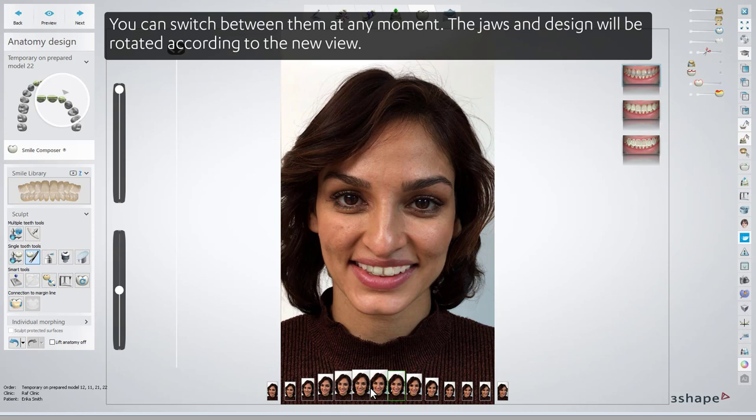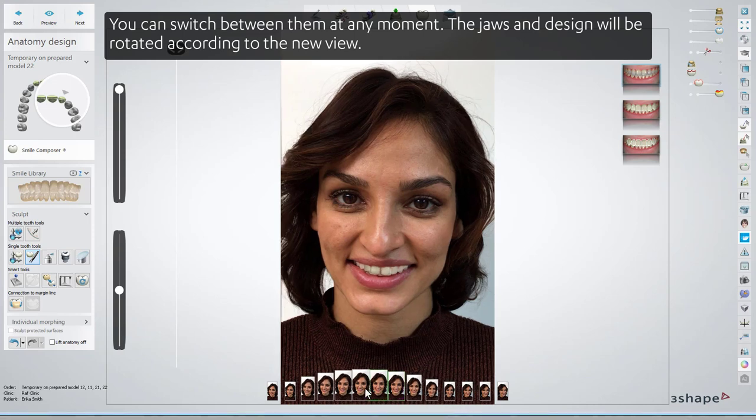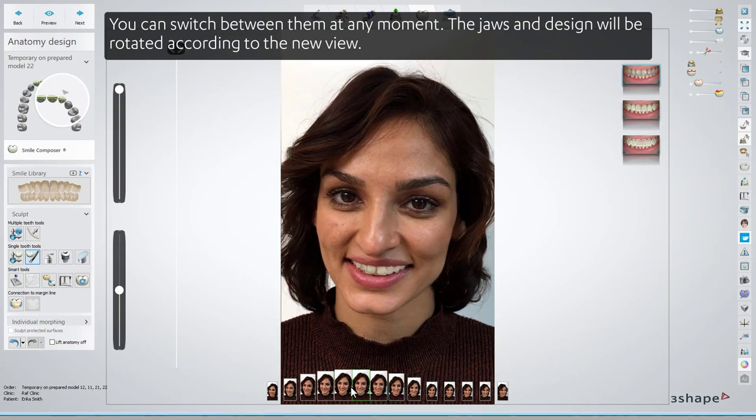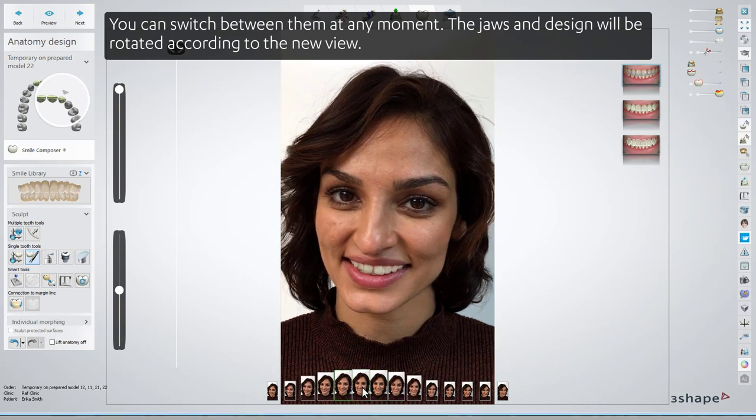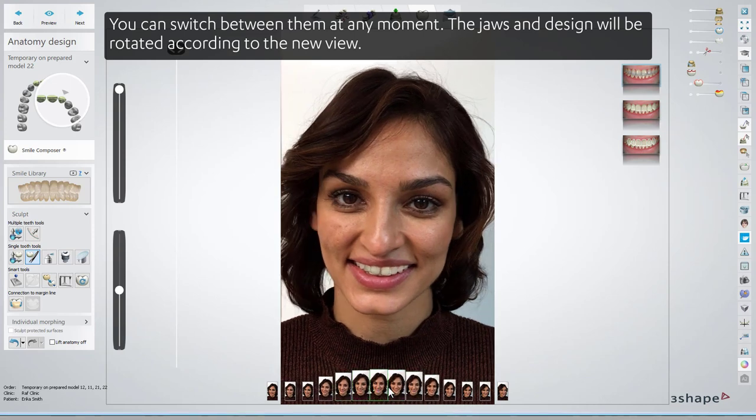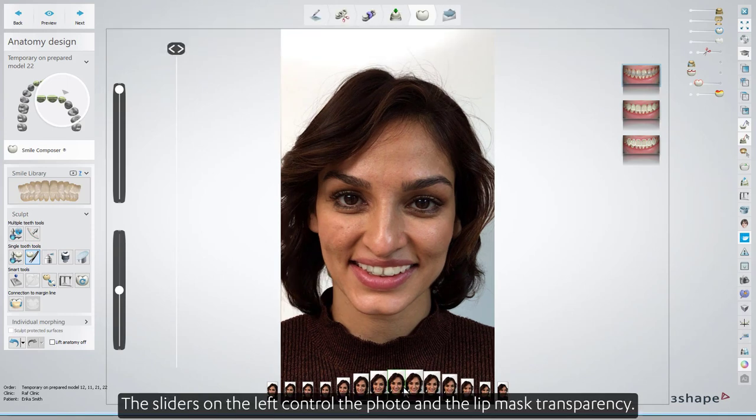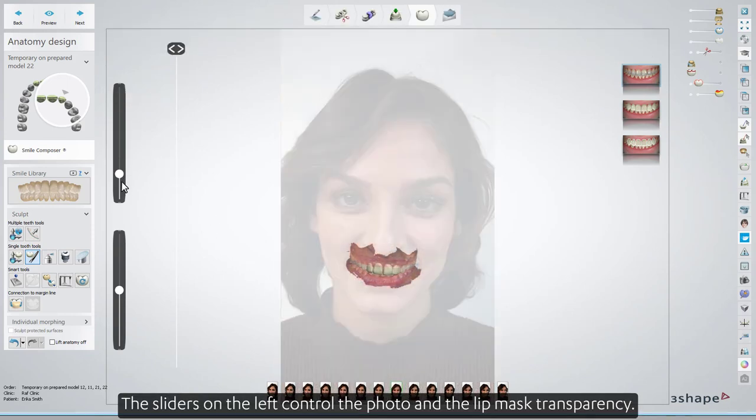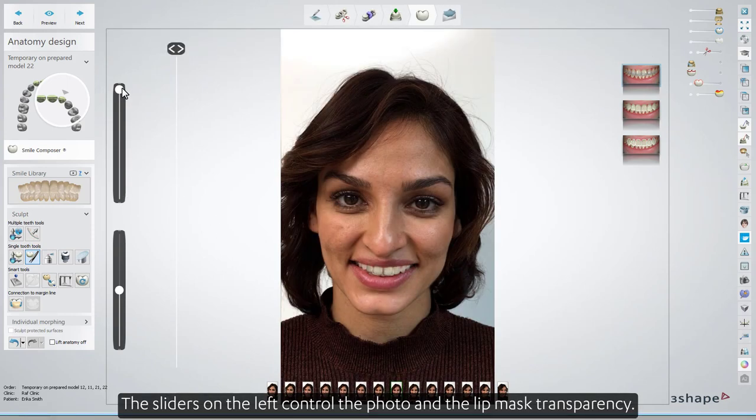You can switch between them at any moment. The jaws and design will be rotated according to the new view. The sliders on the left control the photo and the lip mask transparency.